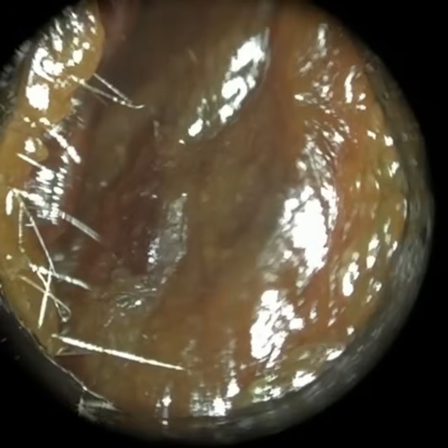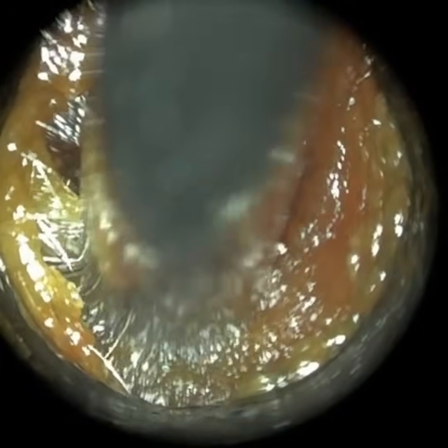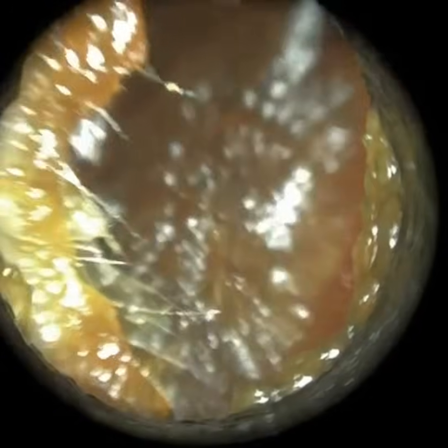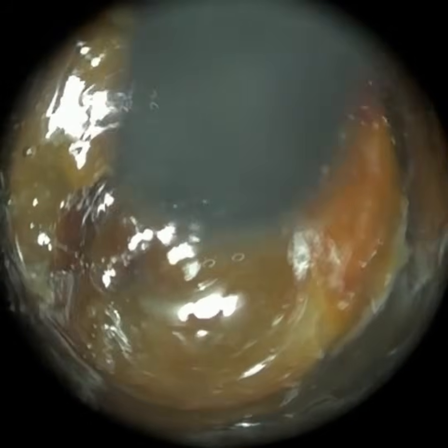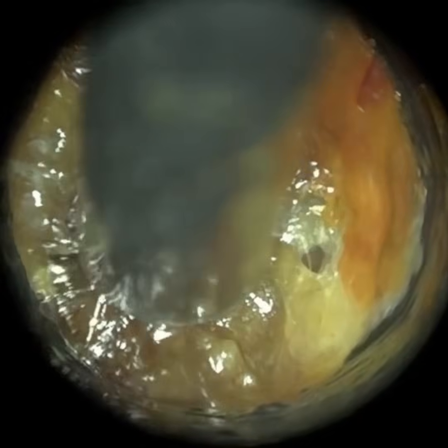Thank you for joining me in my latest video using the WAXscope, and we're using our size 2 teardrop specular. This is our medium-sized specular used for the majority of ears, so your average size ear canals and also larger ear canals. And we have a smaller size 1 specular meant for narrower ears, so pediatric or stenotic ear canals.